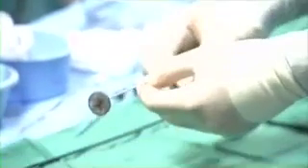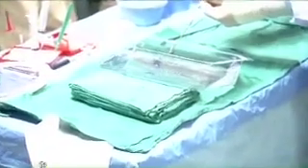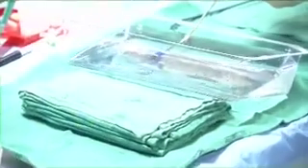Okay. So now we're going to mount the device inside the catheter, and we do it under water, so there are no bubbles, because bubbles also can be a source of embolic events into the brain. Can you focus on this for a second, please? We're putting the device inside the catheter to deliver it, and then we flush it. Very good. So we're flushing this underwater to get rid of all the bubbles that you can see here.